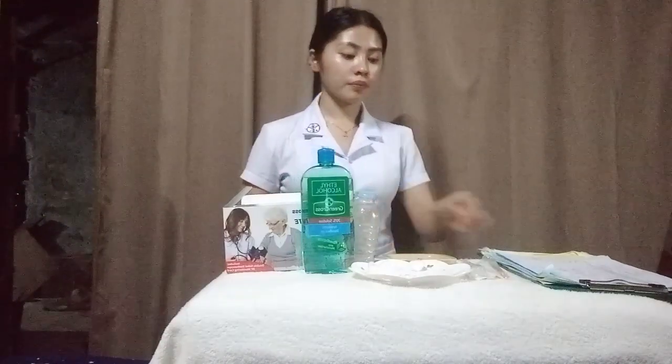So, to prepare medication for subcutaneous injection, we will need to have an insulin syringe. We need to open the sterile cap, take out the syringe, and cap the syringe. Now, draw air into the syringe, just the exact amount of the medication prescribed by the doctor.